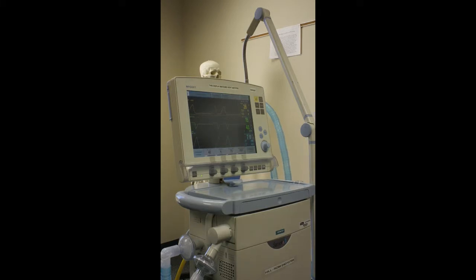All right. And you won't always have rise time, so that's one that sometimes might be NA or a line through. PEEP is PEEP. The set PEEP goes here. FiO2. I to E ratio. And then trigger sensitivity. Remember, trigger can be flow or pressure.